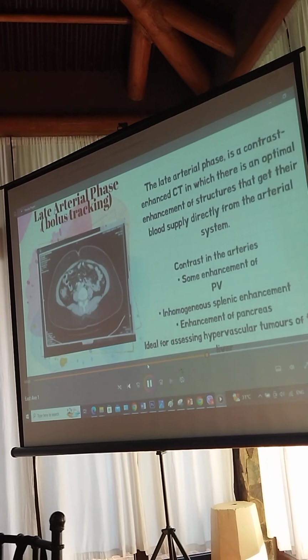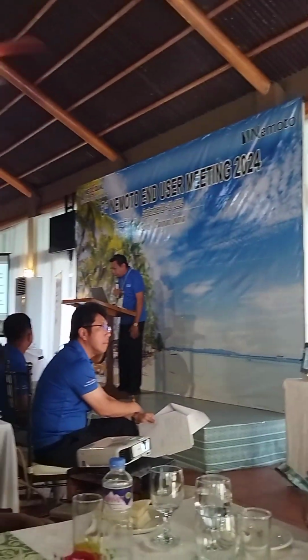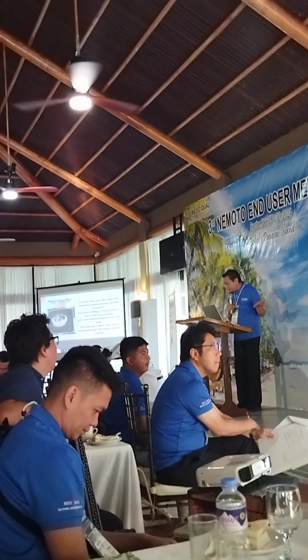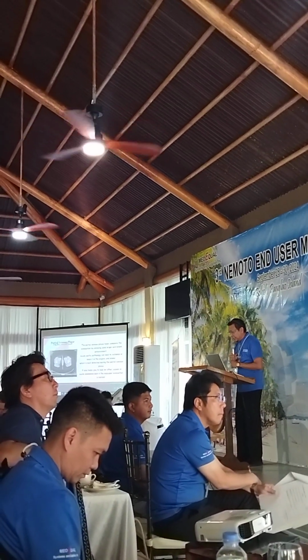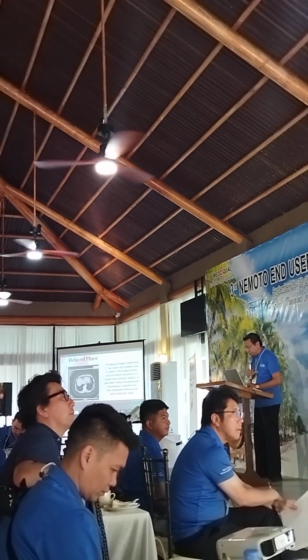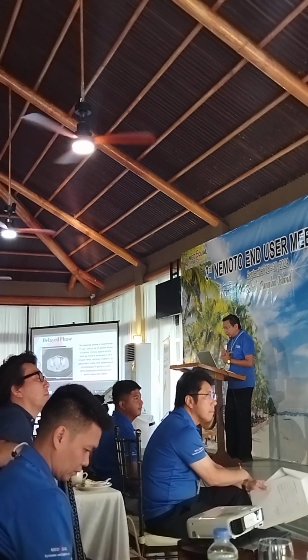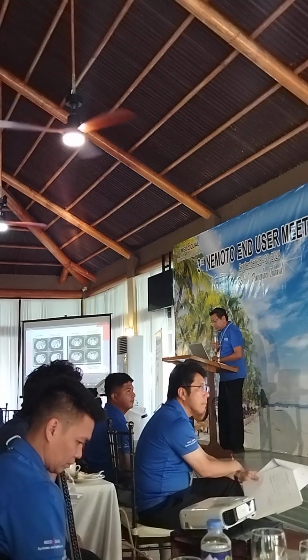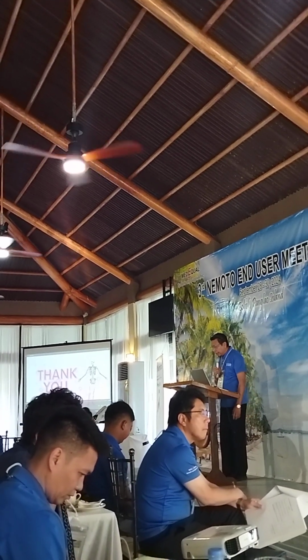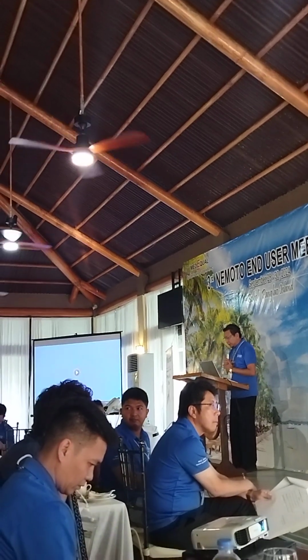Okay? So, while presenting, after the contrast enhanced CT scan was performed, we processed the images through a 3D reconstruction system using the United Imaging UCT 528 and the precise control of the Nemoto Dual Power Injector. We were able to create a highly detailed 3D representation of the liver and the surrounding structures. So as you can see, this allows us to clearly visualize the liver parenchyma, bile ducts, and vascular anatomy, offering critical insights into the patient's condition.